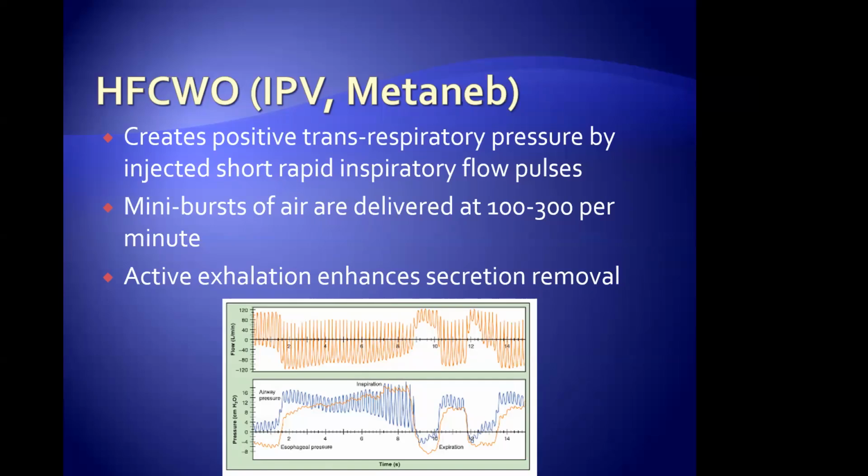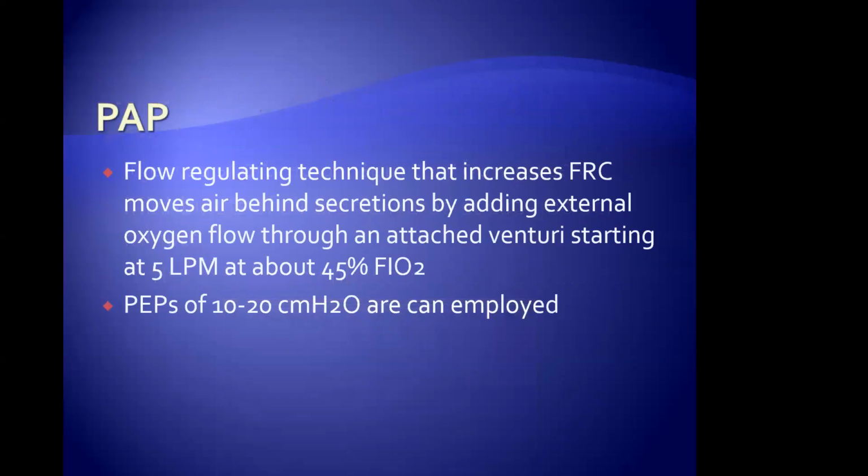So now think about this. That patient that comes in and has pneumonia, can you use it for that? Yes. That patient that comes in with an exacerbation of COPD, has a bunch of secretions there. Can you use this? Yes. Is it effective? Absolutely. And those of us who have had the privilege to do this on patients have seen the positive results of this. It's huge. It's just a great tool for us.